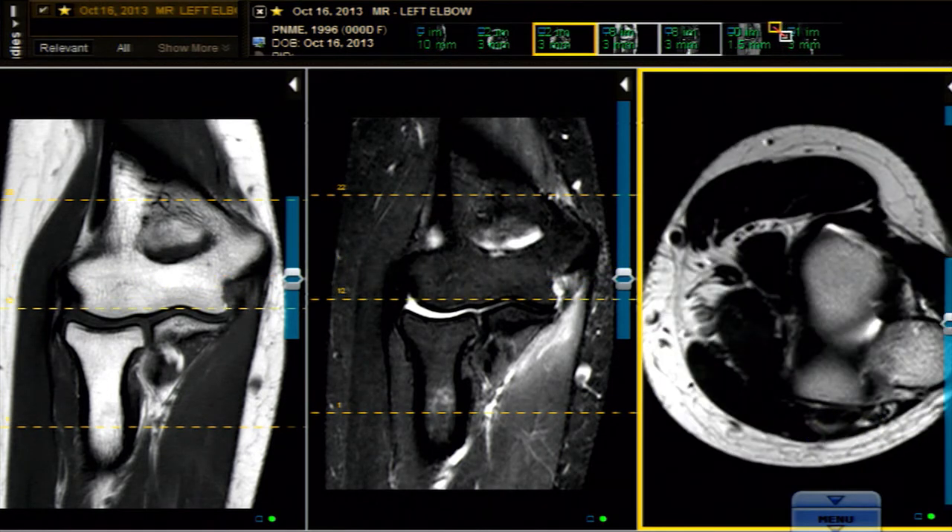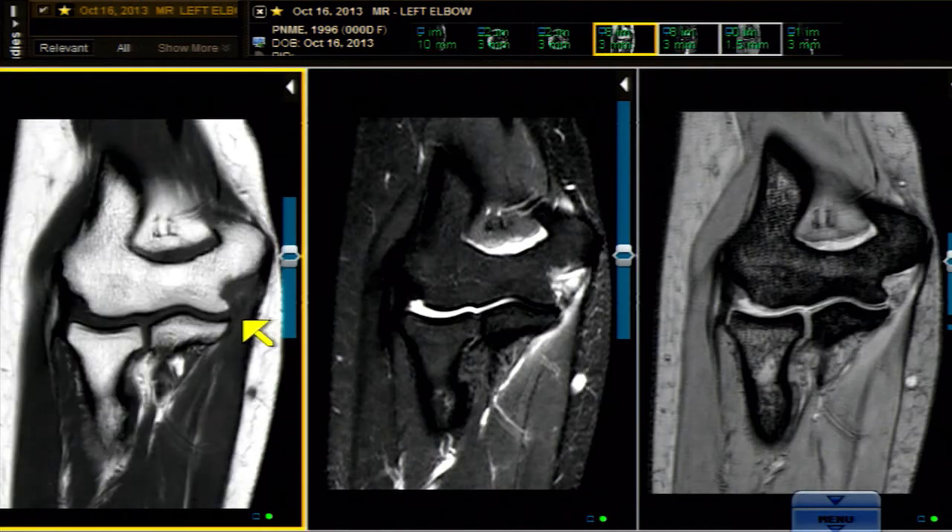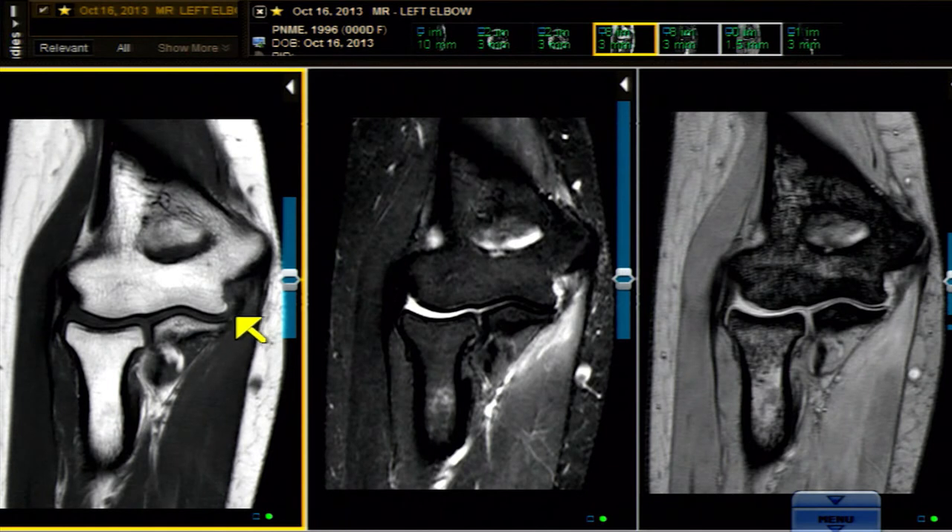Now let's look at them in our most favored projection, which is the coronal. I've got a T1, a proton density water-weighted fat suppression sequence, and the gradient echo — which does a pretty good job with ligaments but not so much with bone. Starting out with the T1.